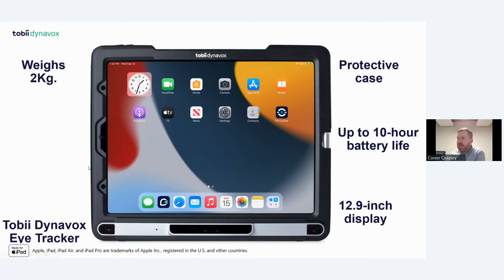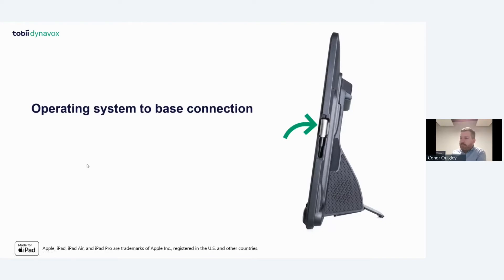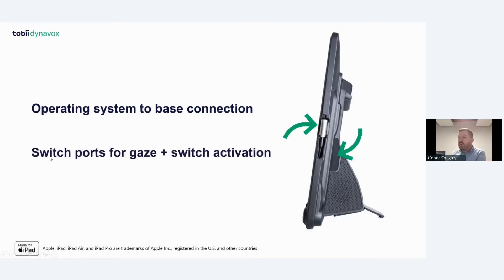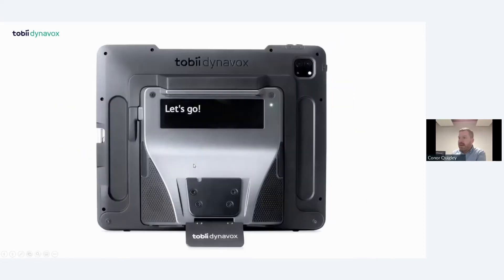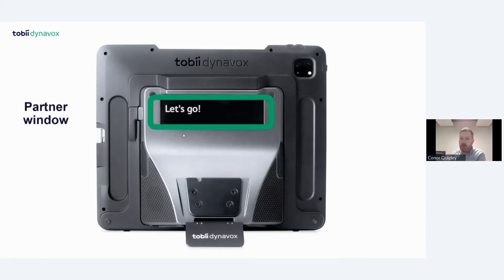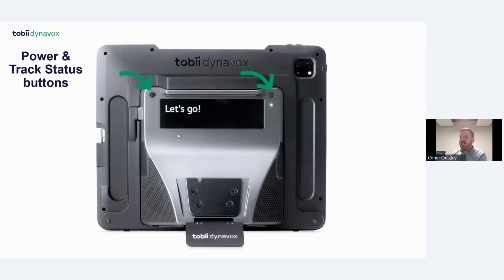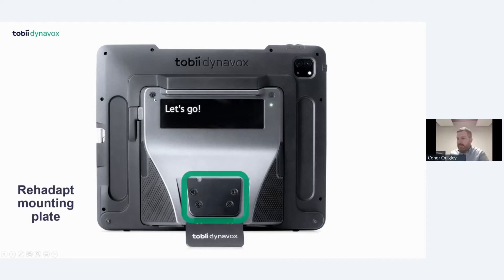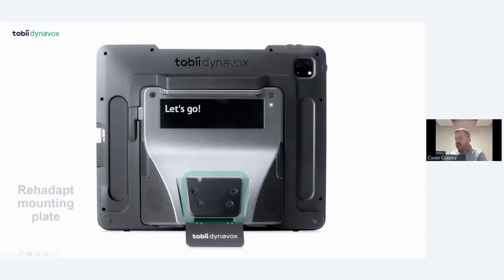From the side, there's one connection that links the TD Pilot to the iPad for speakers and switch ports. You've got switch ports on the side, switch activation on the back, a rear-facing camera, and the partner window that works with TD Talk and TD Snap. There's a power and track status button on the back — useful for the communication partner to quickly check device positioning — and a REHADAPT mounting plate compatible with wheelchair mounts, table stands, or floor stands.